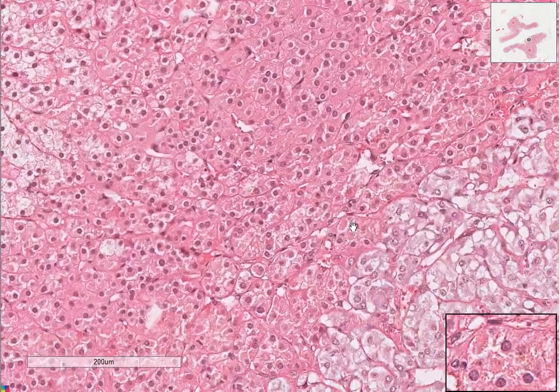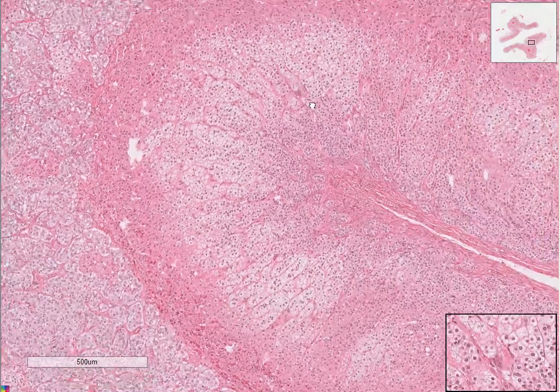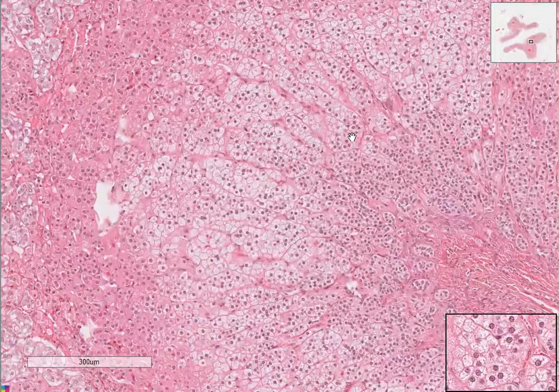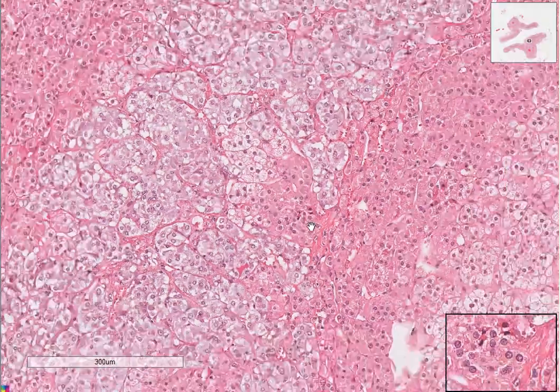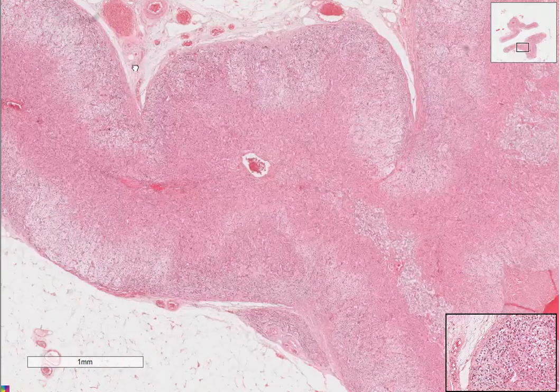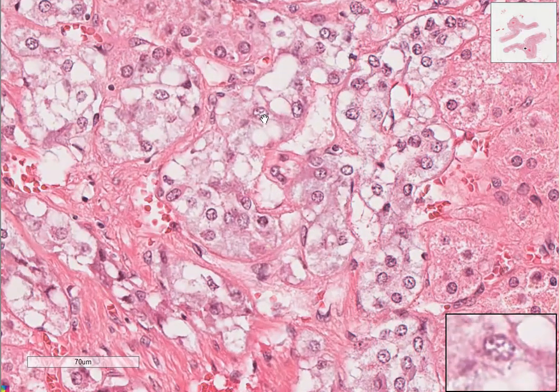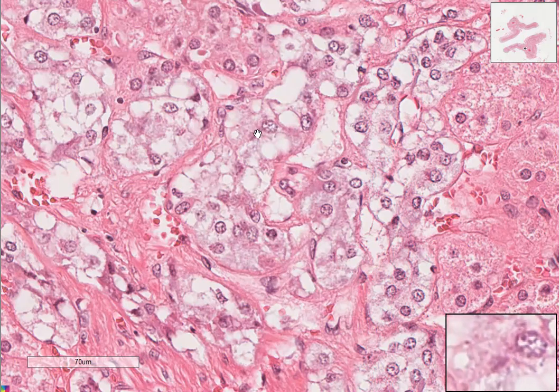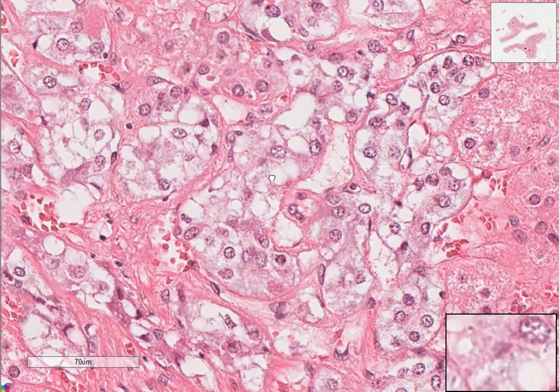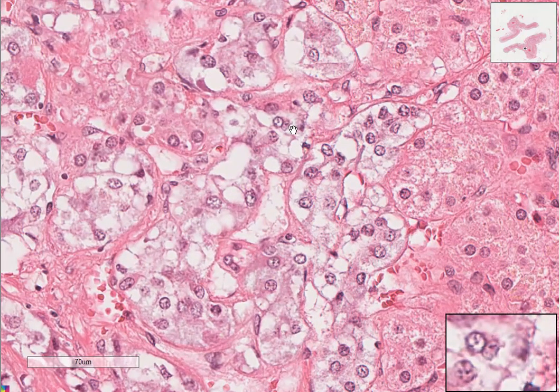So now, deep to this, we've got the adrenal medulla. And in the adrenal medulla, the nuclei are a little bit more salt and pepper. Let me just show you nicely. You can see there the nucleoli are very inconspicuous, but some others describe it almost as salt and peppery. This is where epinephrine and noradrenaline are secreted.